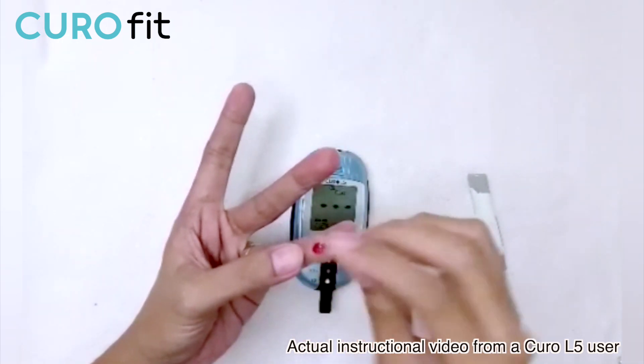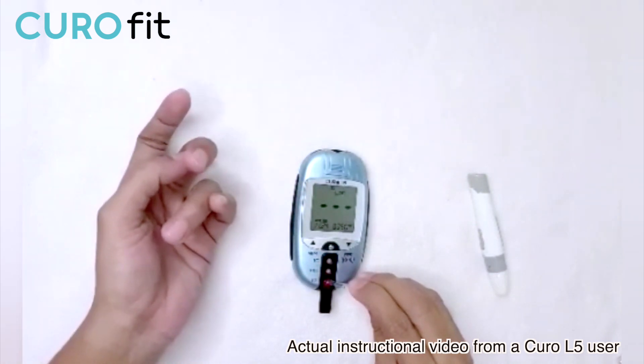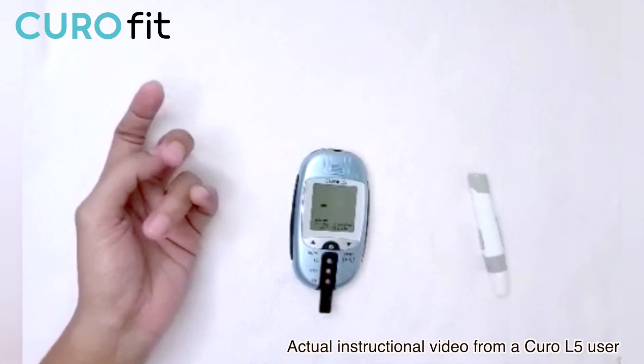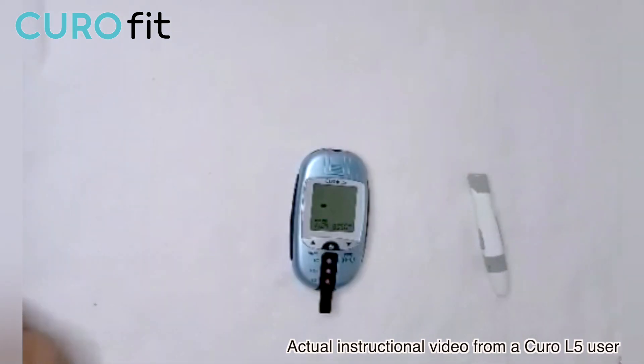For the third sample, we need to use a new capillary rod again. Fingers should be at a 90-degree angle, and when applying the blood sample, it should be at a 45-degree angle. Once you hear the beep, then that's good to go.